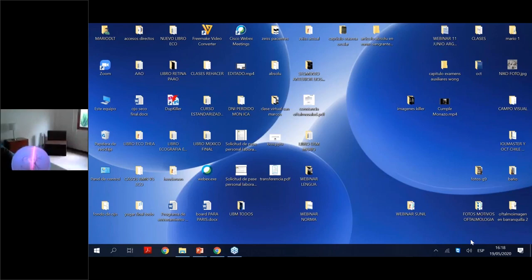In this case 12. And if I want to go to the macula, I can go a little bit central or nasal. Then, this is so easy, you can practice the position of the ultrasound, and you can make transversal and longitudinal and also axial scans. At the moment it's very difficult to make an axial because you can't see anything. Then it's a very easy way to understand what you are scanning. If you are transversal, in this case, you are longitudinal if you are this way.